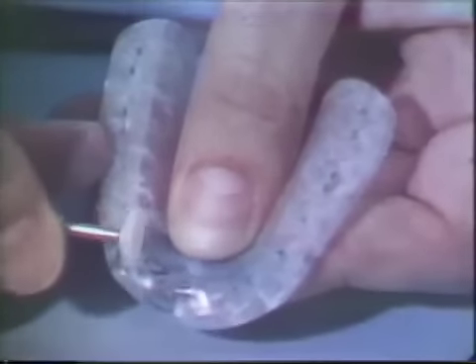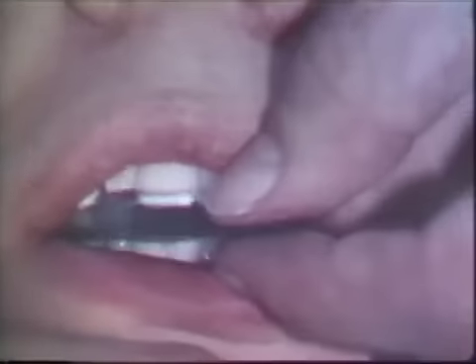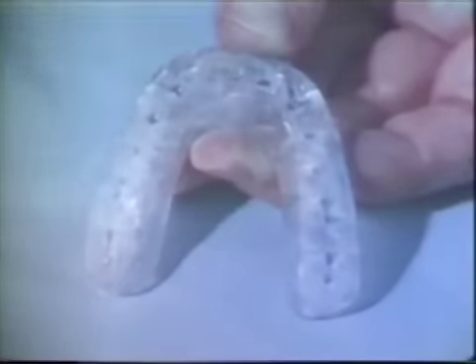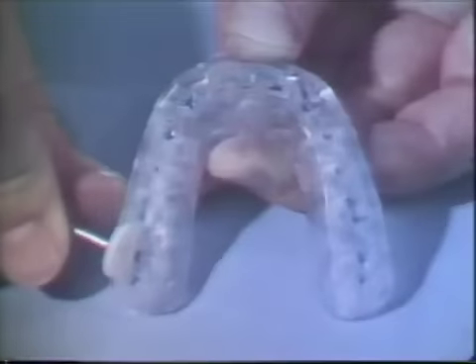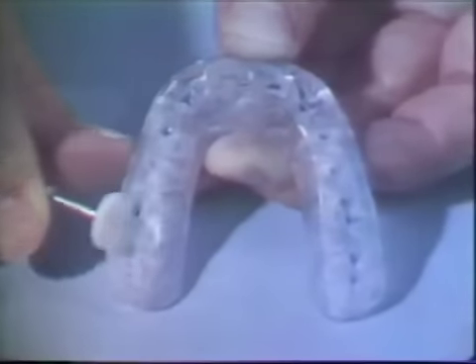The cuspid guidance should begin about one millimeter from the centric stops. Lateral and protrusive excursions are registered again with carbon paper. Both protrusive and lateral excursion patterns are now smooth. However, there still is some lateral guidance from a wide contact registered in the right second molar area. There should be small narrow centric contacts in the acrylic but no evidence of lateral guidance. Therefore, the buccal aspect of the marks are eliminated.